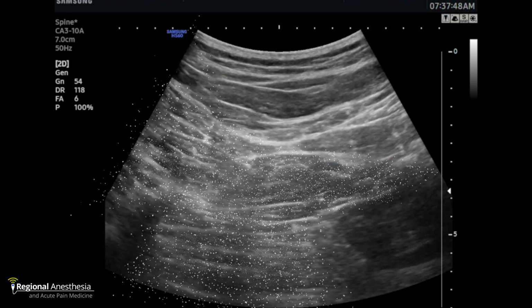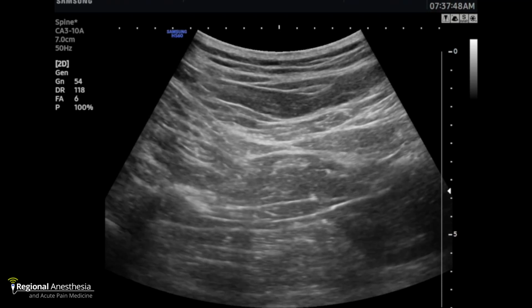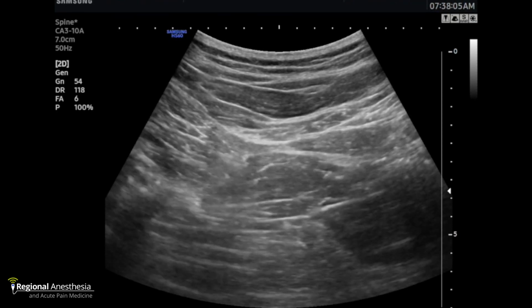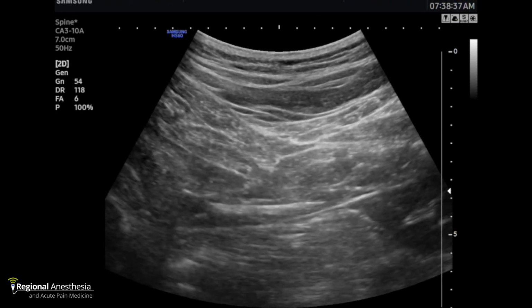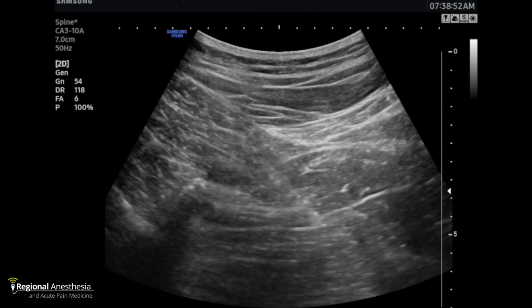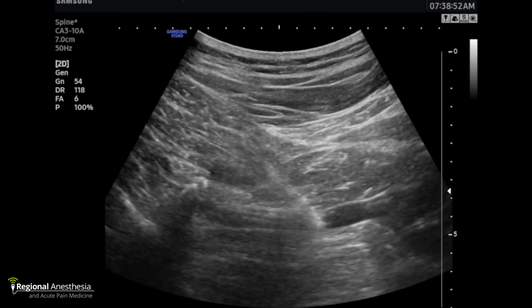So what we do now is we turn up the nerve stimulator to like 2 or 3 milliamps. Like that's a huge current. And as the needle comes across the screen, you'll see the muscles contracting directly like dink, dink, dink. So here we go. Here's a needle in the erector spinae muscle now, and you can see it contracting. Dink, dink. And then we pass into the QL, and there's a cute little QL going dink, dink, dink. And then as you pass through the QL and into the correct plane, you lose the twitch. No twitch now. Inject, beautiful, right in the correct spot every single time.